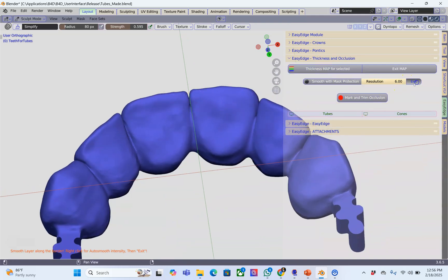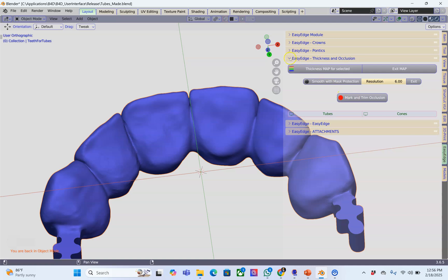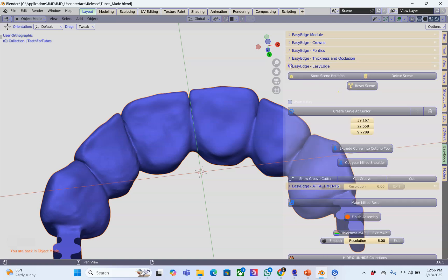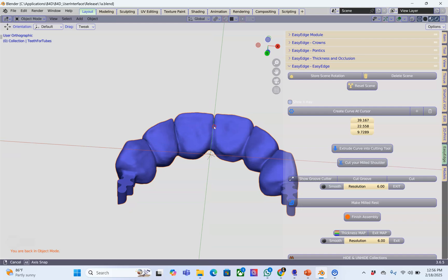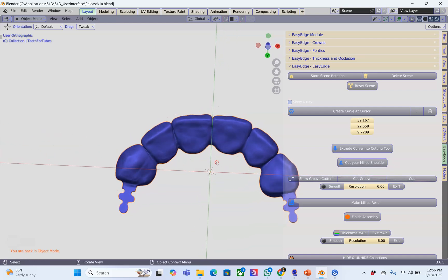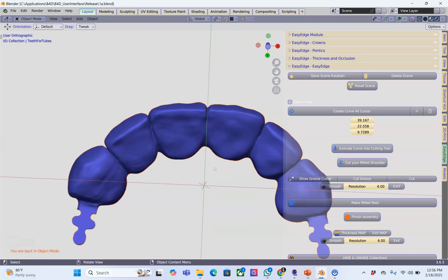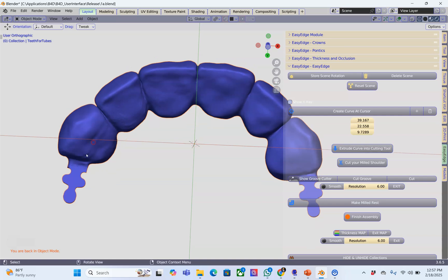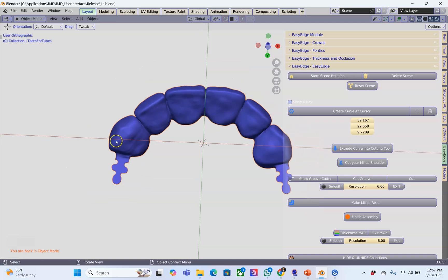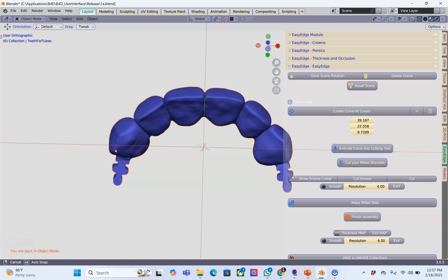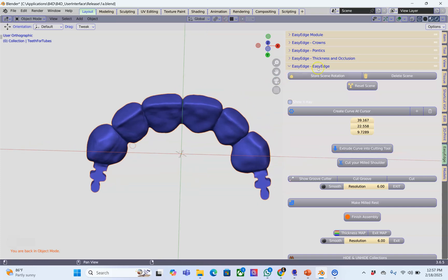The next red button is to mark the occlusion but we don't have an antagonist. Now what I want to do is store the scene. It's not that important to be parallel to these attachments because what I want to do is carve out the labial surface of these so it'll be a milled edge but on the other side. I'm just going to have a look at it and we're going to store the scene.